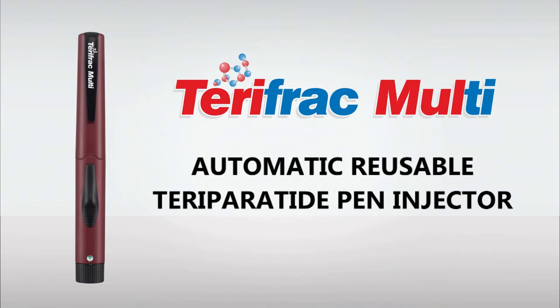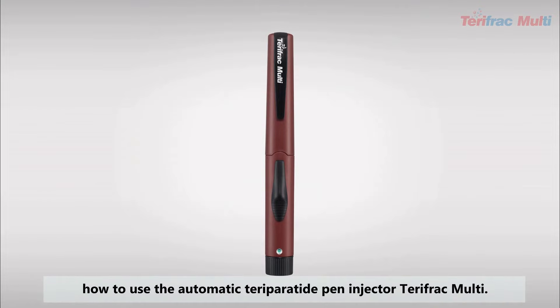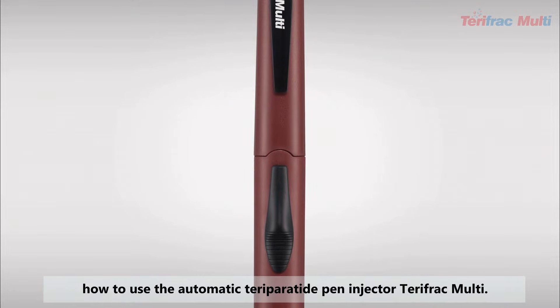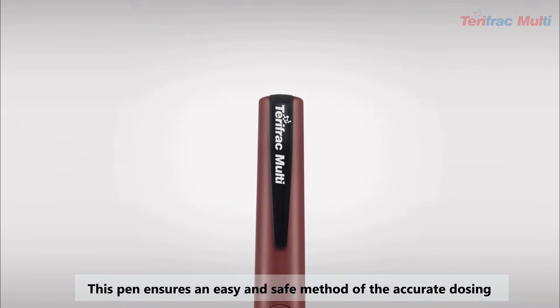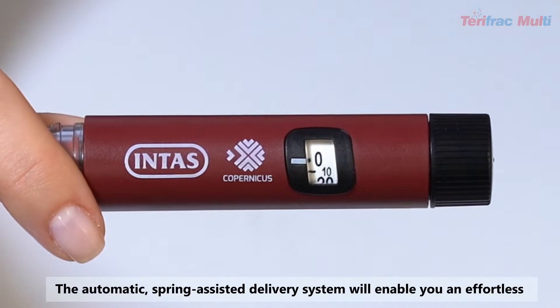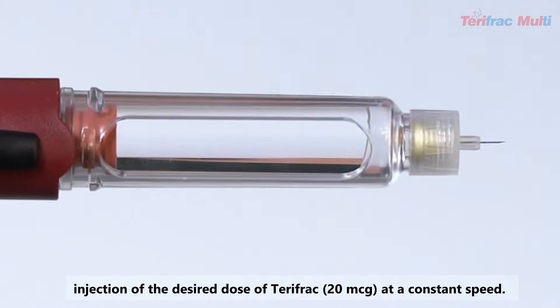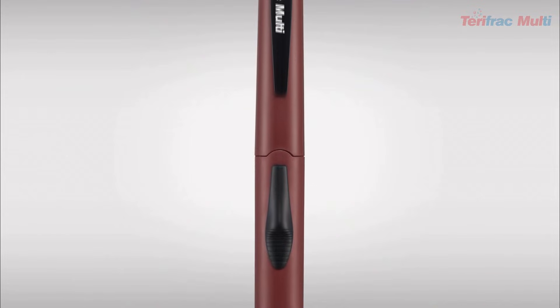Welcome to this quick guide which will instruct you how to use the automatic Teriparatide Pen Injector TerriFrac Multi. This pen ensures an easy and safe method of the accurate dosing of your Teriparatide. The automatic spring-assisted delivery system will enable you an effortless injection of the desired dose of TerriFrac 20 microgram at a constant speed.